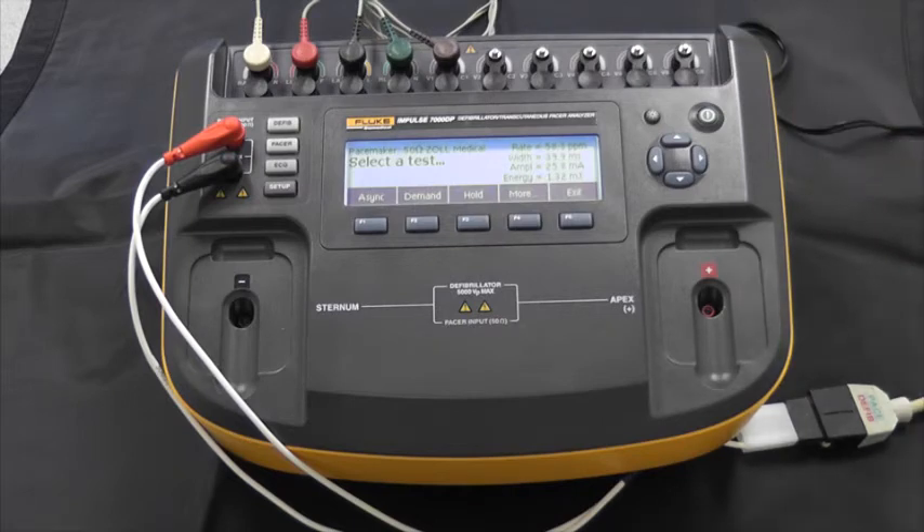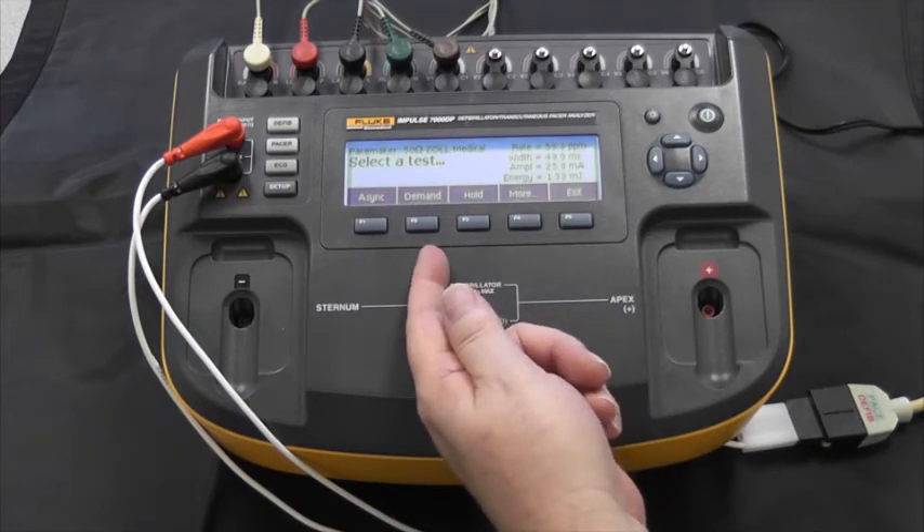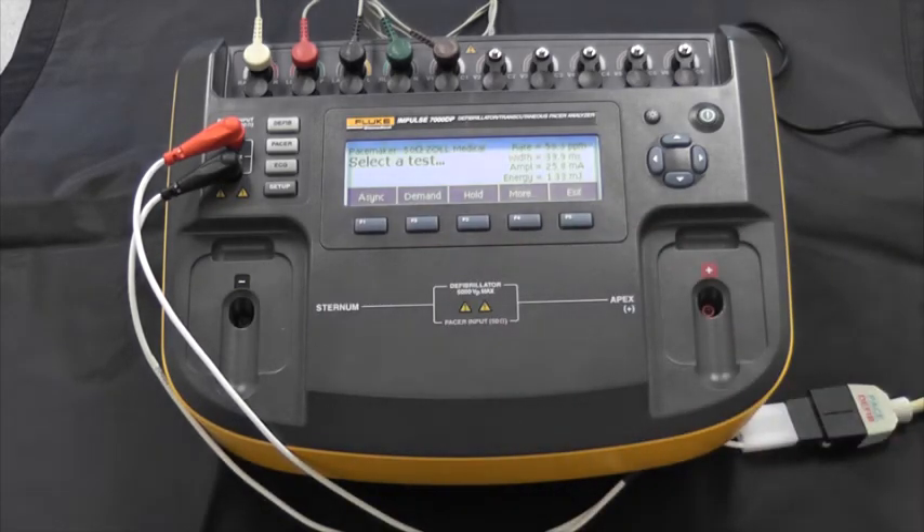These are all of the pacer parameters that we would test, and you will always do a pacer parameter test. In addition to those tests, you will have other tests required not only by the international standards, but also by the manufacturer — those would be asynchronous tests or demand mode tests, and a few more depending on what the manufacturer requires.